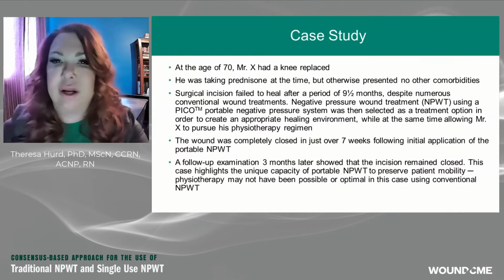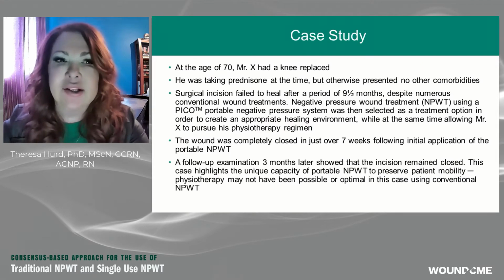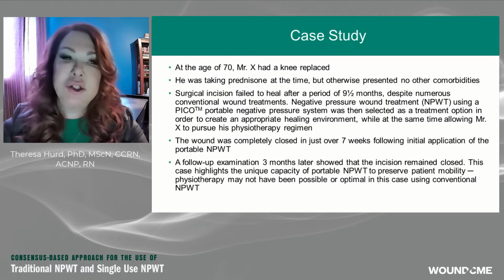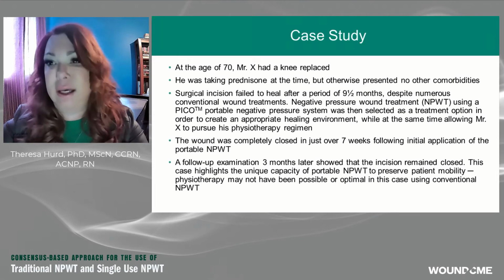He is definitely going to help you with this. So I'm going to conclude my end with a quick case study, just to give you an idea of one of the incidences. This was the type of negative pressure we used. We had a gentleman who was 70 years old, post knee replacement, over 9.5 months.